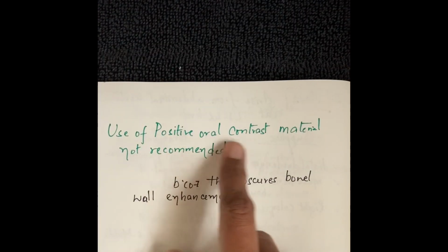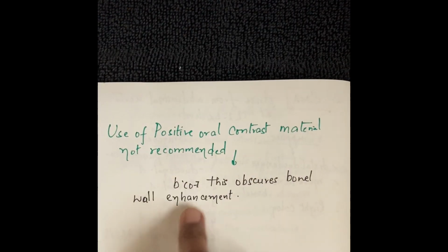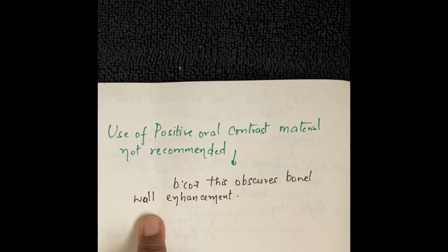Positive oral contrast material is not recommended because it obscures the bowel wall enhancement.